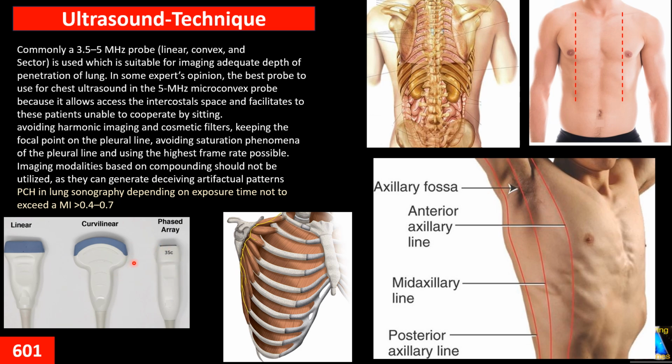As I mentioned before, one of the most important fundamental principles for ultrasound of the lung is artifacts. In other words, just the artifacts that are created in ultrasound help us to diagnose most of the important pathology in the lung.